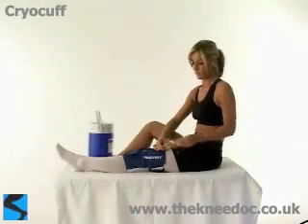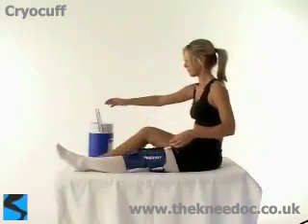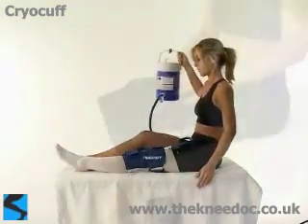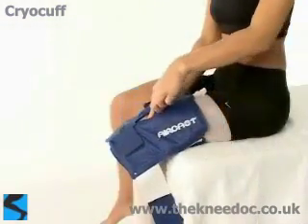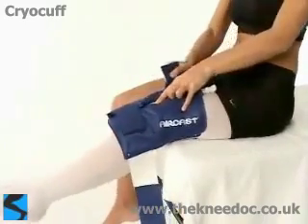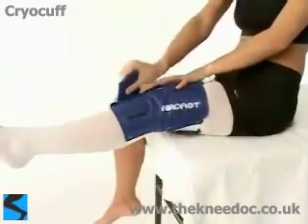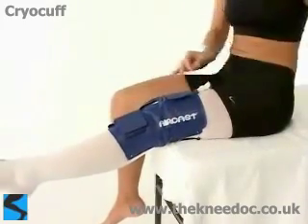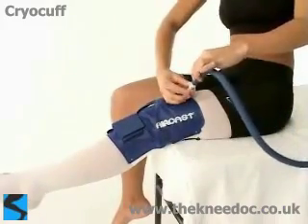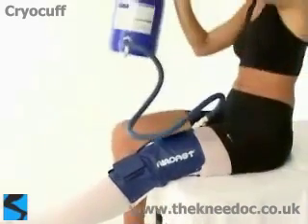Once the Cryocuff is on the leg, the nozzle at the top of the sleeve is connected to the canister, which has a mixture of ice and water in it. Once the canister is connected, the nozzle on the lid at the top of the canister must be opened in order to allow flow into and out of the Cryocuff. It is then simply a matter of gravity, in that the canister is lifted above the level of the Cryocuff and held there until the Cryocuff feels tight and is filled with ice cold water.